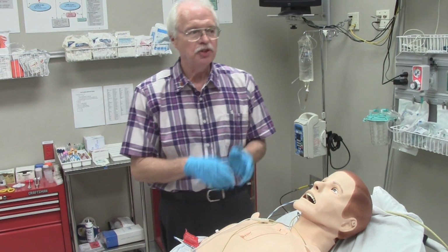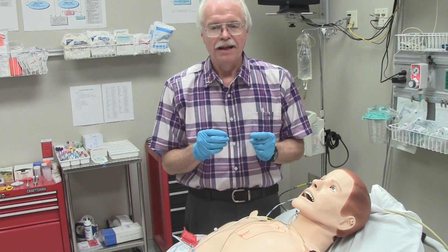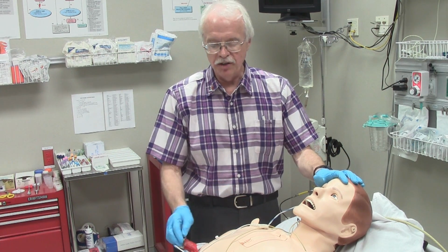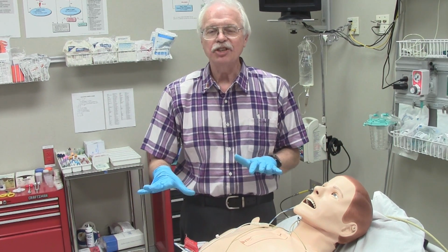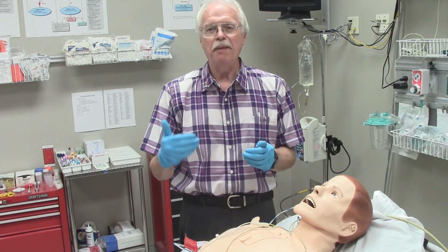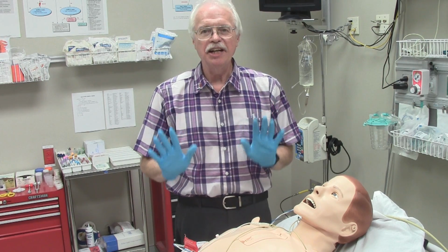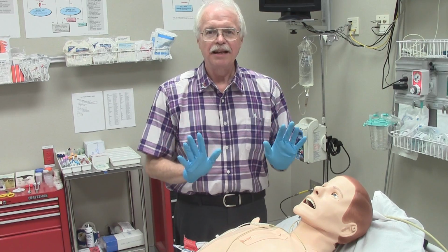You can use electricity from an actual patient monitor. We do caution everyone to remember that even though it is a simulated patient, it is real electricity. And even though the patient is mostly plastic, he does have some metal components, so there's always the possibility that he might have become grounded. When you shock this patient, clear the way you would clear if you were shocking a real patient.